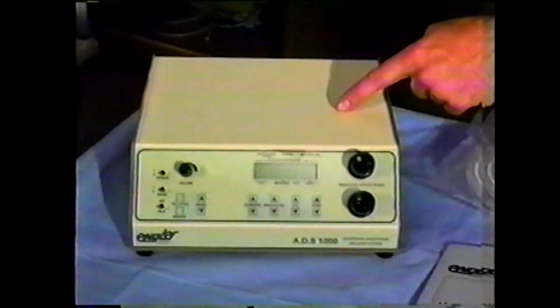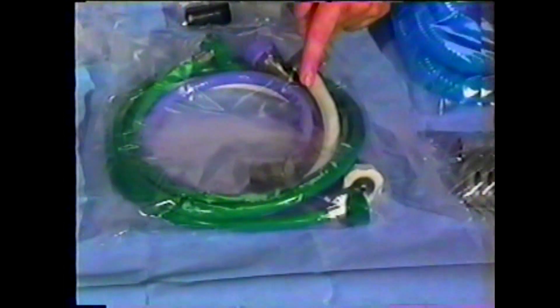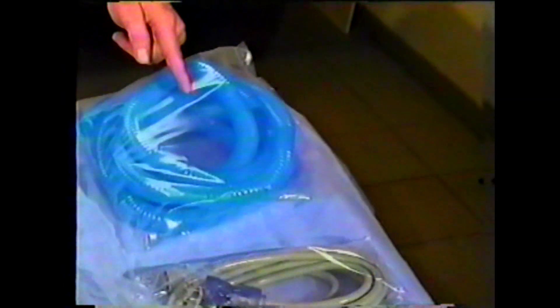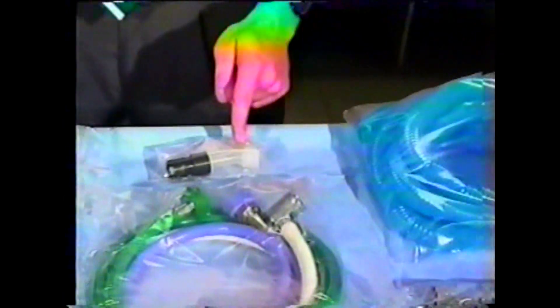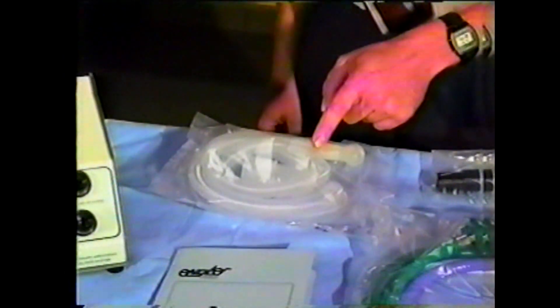In each ADS package, you will find the ADS-1000 unit, the ADS instruction manual which should be read carefully, a medical grade electrical cord, 12 feet of scavenger tubing, a mask adapter which must be used for masking procedures, and a disposable pediatric breathing circuit.